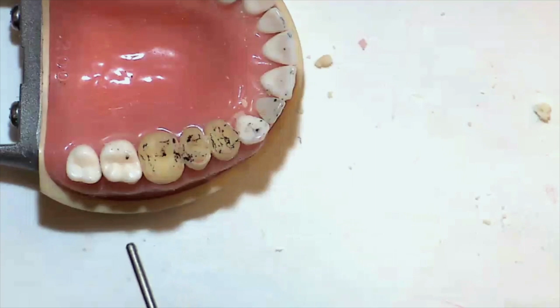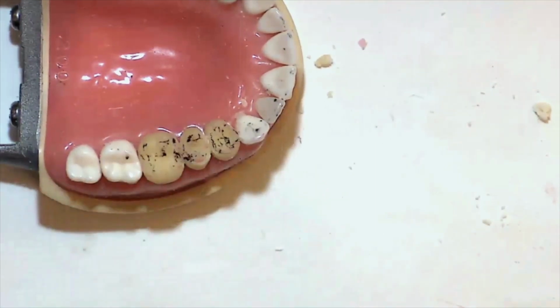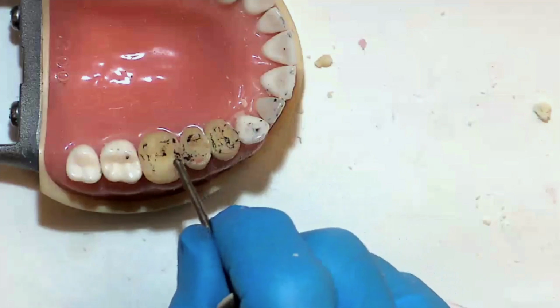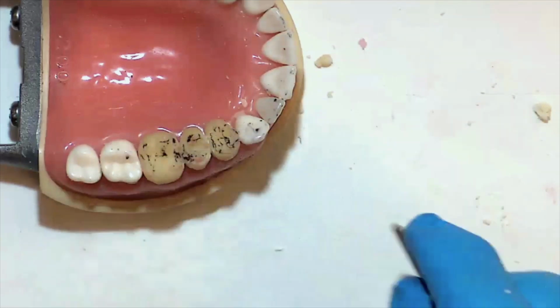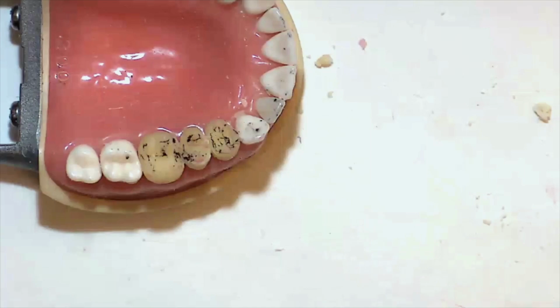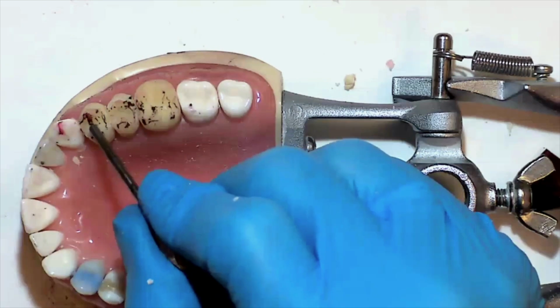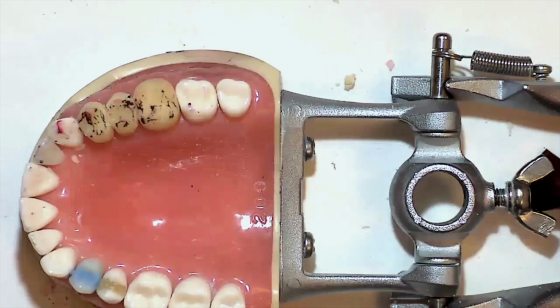We've now completed most of our carving and remarked with some articulating paper in our maximal intercuspal position. You can see we have pretty good contact on the palatal cusp and some of the interproximal central fossa of the maxillary molar. Here we've marked the lateral excursions. You can see the canine, the first premolar, and the second premolar, not so much on the molar.